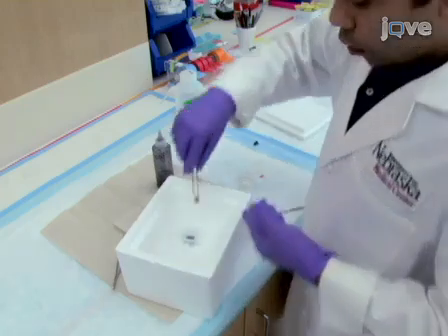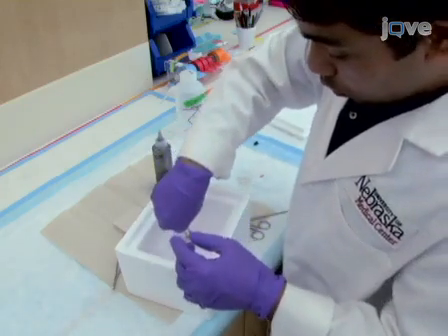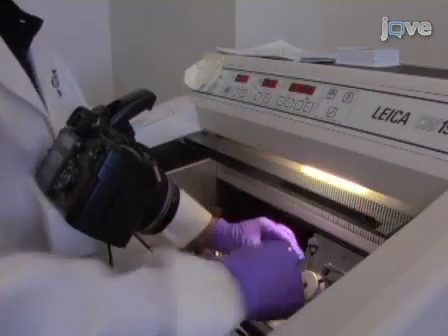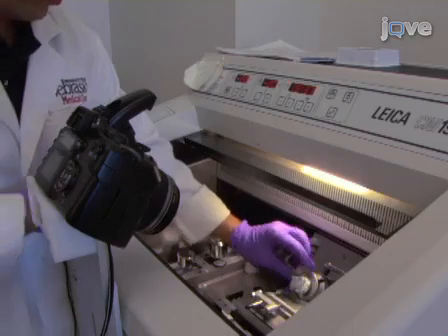After the final MRI scan in the series, perfuse the mouse, remove the brain, and embed it into a block of OCT compound which has been darkened using a drop of India ink. Then, place this block in a cryostat for slicing and histological analysis.